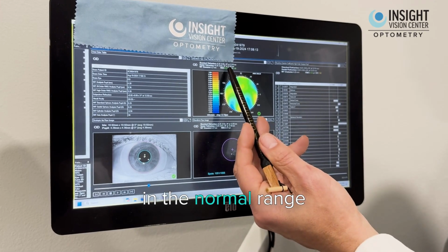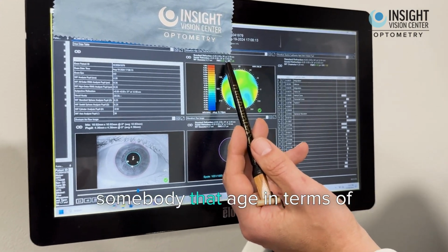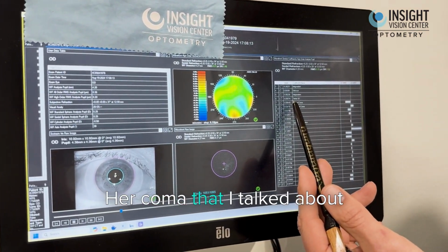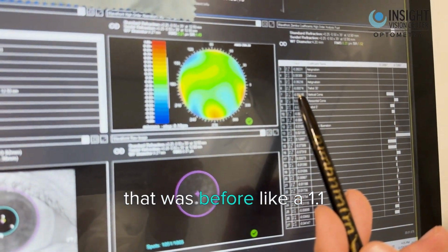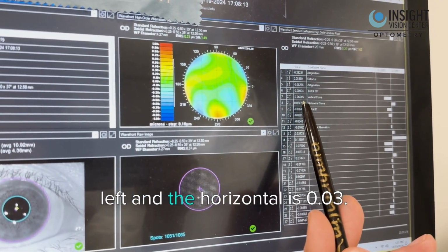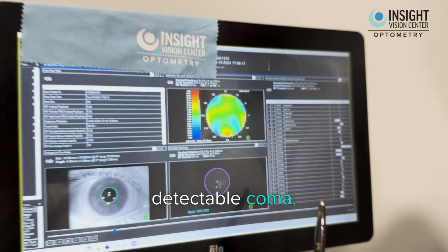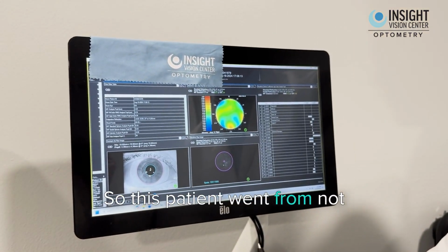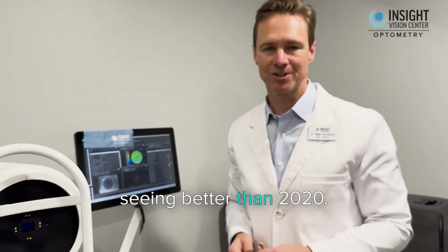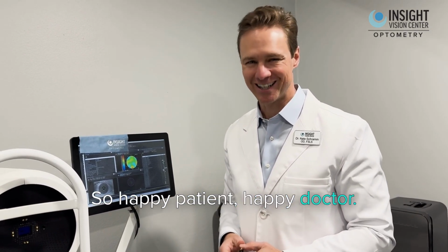And she's now in the normal range, all in the green, right about what we'd expect for somebody that age in terms of the amount of aberration. Her coma that I talked about, that was before like a 1.1 something, is now 0.06, and the horizontal is 0.03. So that's not even detectable coma. So this patient went from not even being able to see the big E on the chart to now seeing better than 20/20. She's actually 20/15. So happy patient, happy doctor.